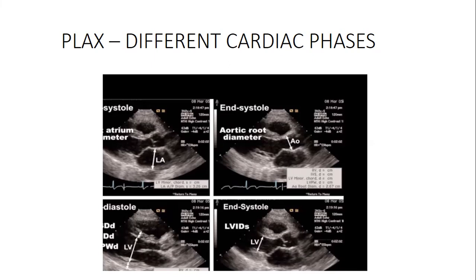Now, how do you marry it with this phenomenon of the Nyquist limit? The Nyquist limit will help you to demonstrate the wave or the sample gate. The machines have been designed to measure a specific limit of velocity.